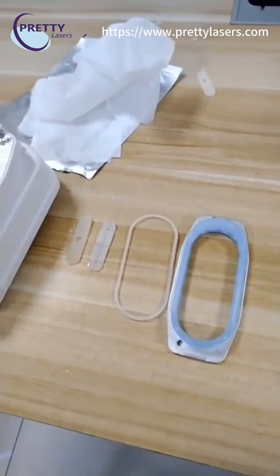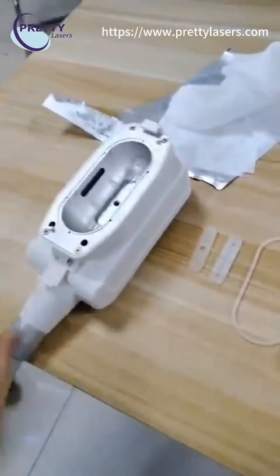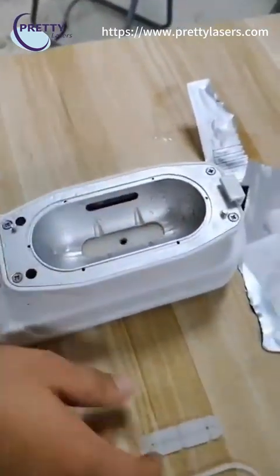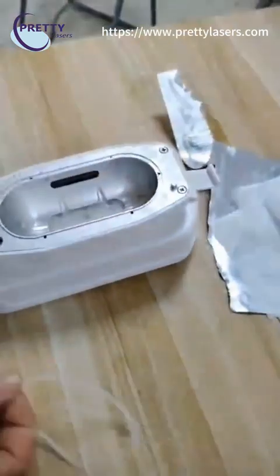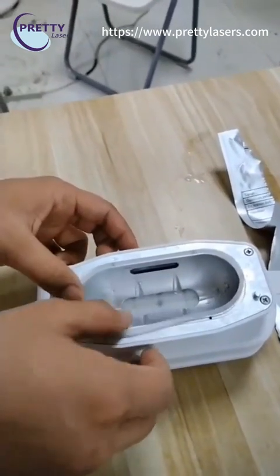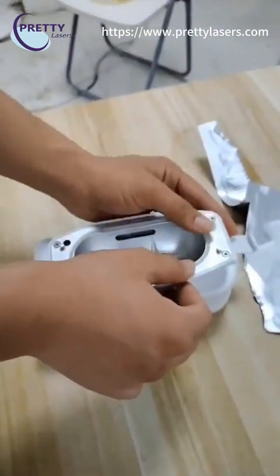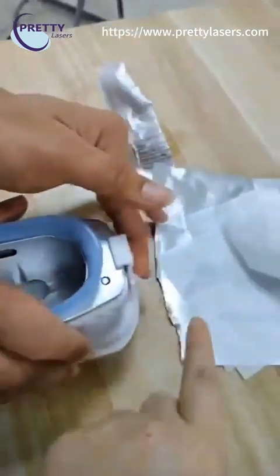Now we show how to install the handle. These are the coin, the silicon rubber, and the replacement pad for the small handle. First, put the coin inside, then put the silicon on it, put the rubber on the handle to make it tight, then put the replacement pad on it and tighten.